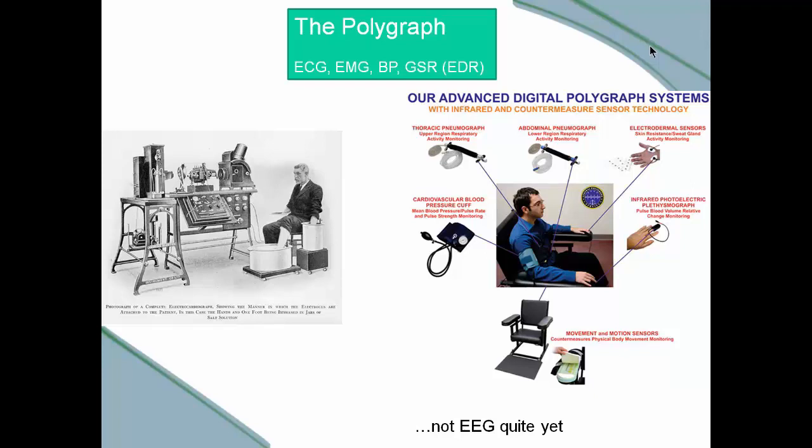That's the polygraph. So now I also have a polygraph that I can show you, and we've got this very, very simple, very basic polygraph, and so we can look at three things with that. We can look at electrodermal response. We can look at respiration and breath jitter as well. And we can look at pulse or heart rate, because clearly, if you feel anxious all the way up to a point where you feel scared, your heart rate jumps up.